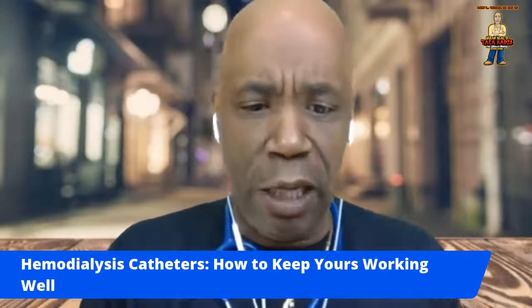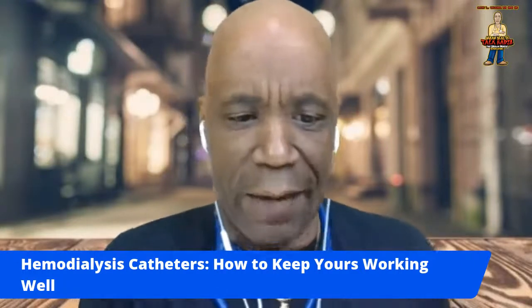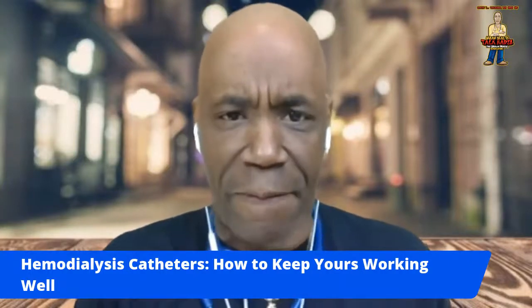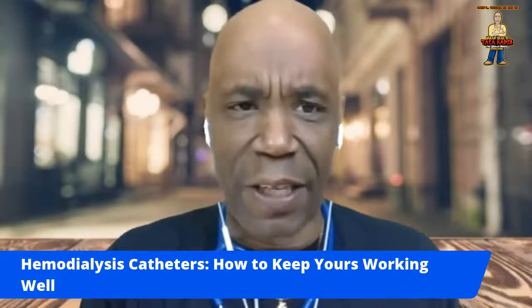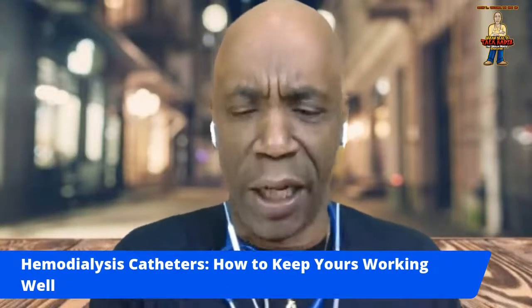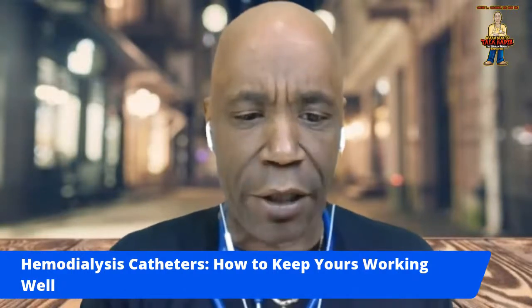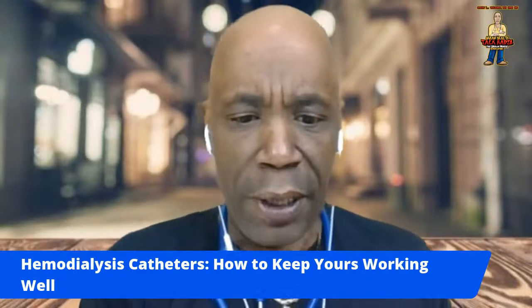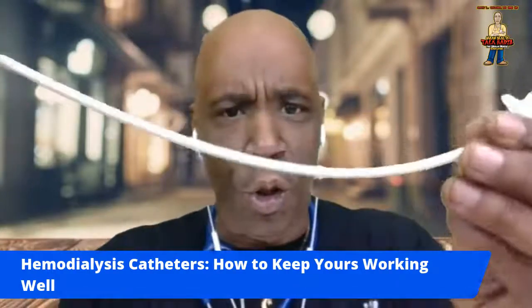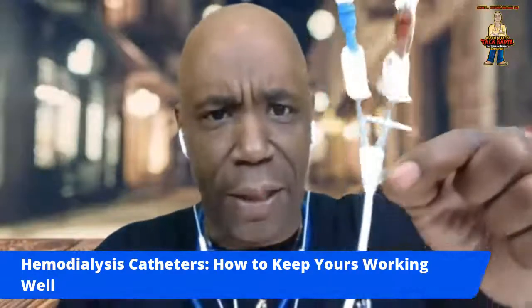Now, if you receive hemodialysis, your access is one of the following, which I said, an AV fistula, which is made by joining an artery and a vein in your arm, an AV graft made by using a soft tubing to join an artery and a vein in your arm, and a catheter, a soft tube that is placed in a large vein, usually your neck. And this is the tube that they're talking about right here, the hemodialysis catheter.